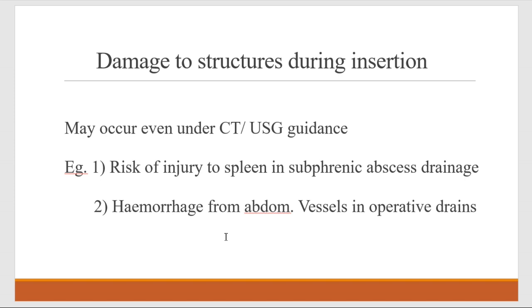Damage to structures during insertion means this damage may even occur during CT guidance or ultrasonographic guidance. So it is possible, so be careful. For example, if somebody is draining a subphrenic abscess, the risk of injury to the spleen is there.